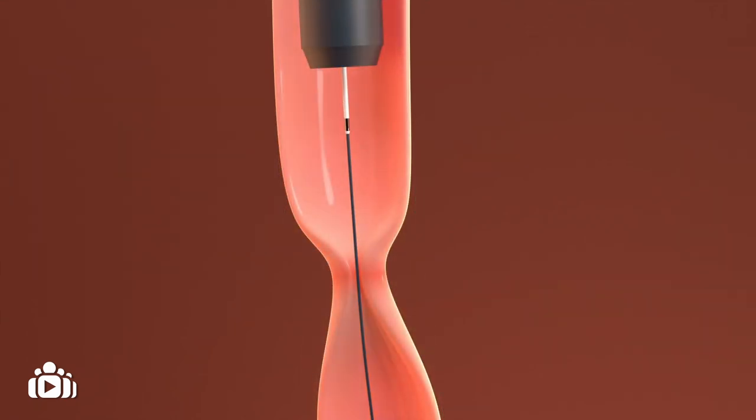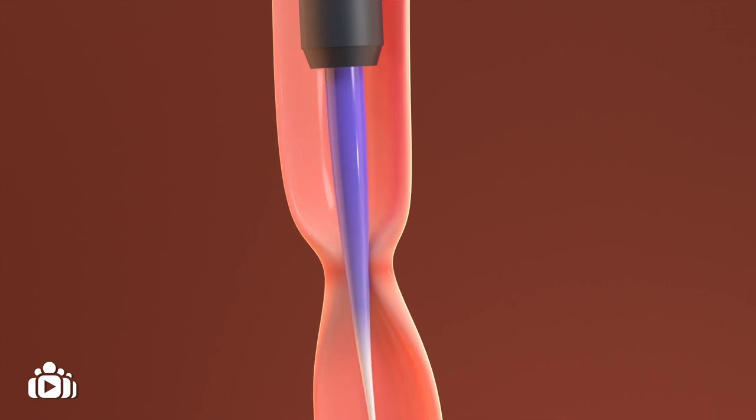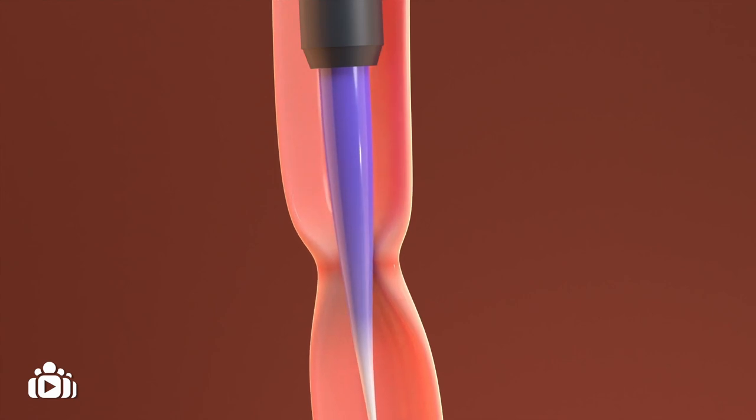Another way is to use the endoscope to pass a tapered elastic tube called a bougie into the esophagus to the stricture. During the dilation procedure, the doctor will use several tubes one after the other, and the tubes get wider each time. This gradually stretches the stricture.